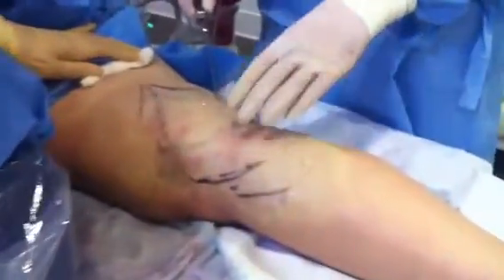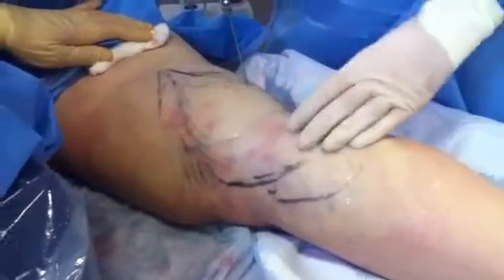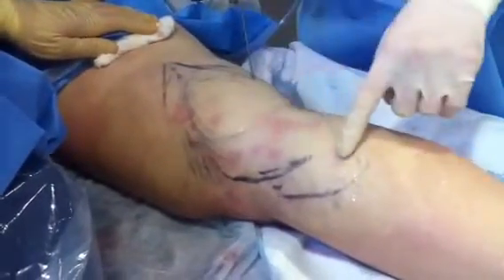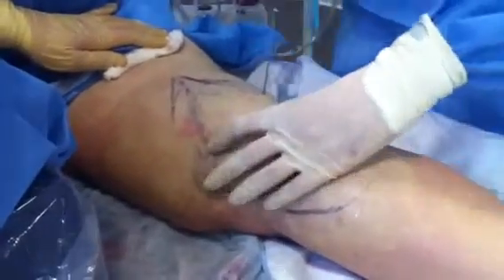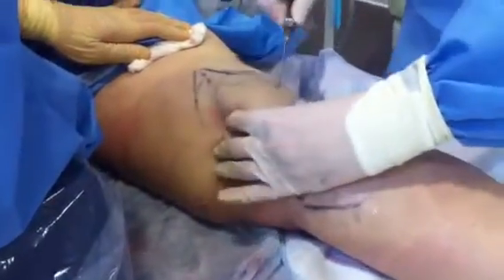I'm using a very small cannula — this is a 14-gauge, very small — and we're actually going to start to remove this area that we've marked out. You're going to hear the vacuum coming on so we can actually aspirate the fat.